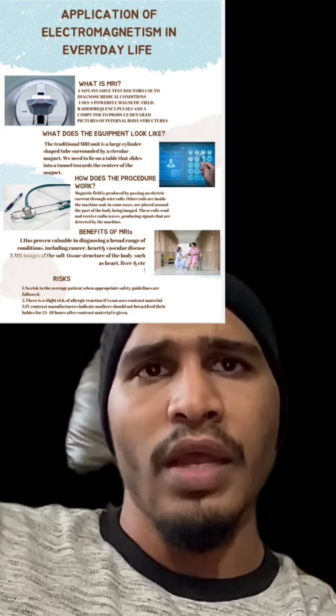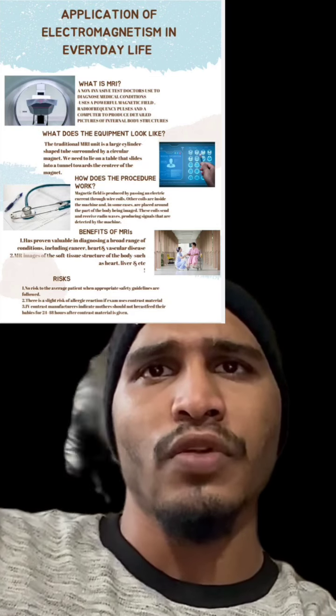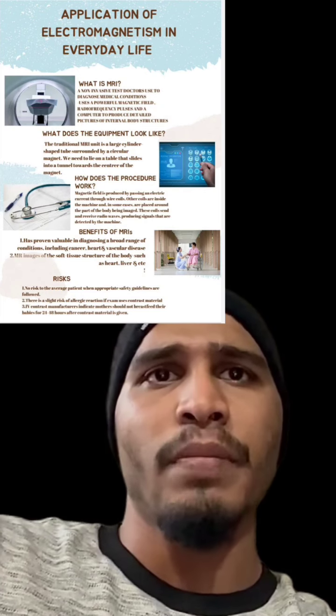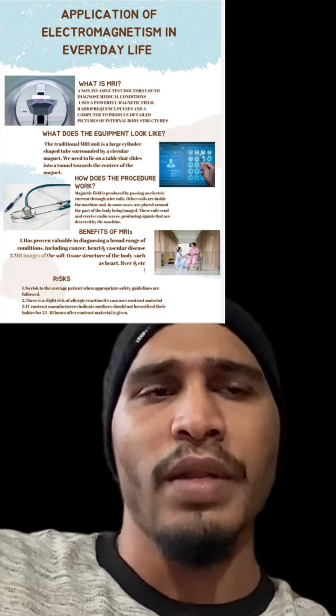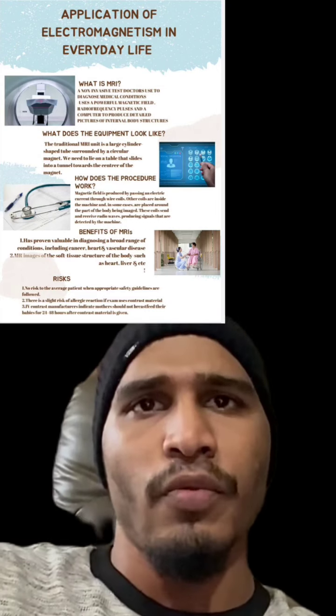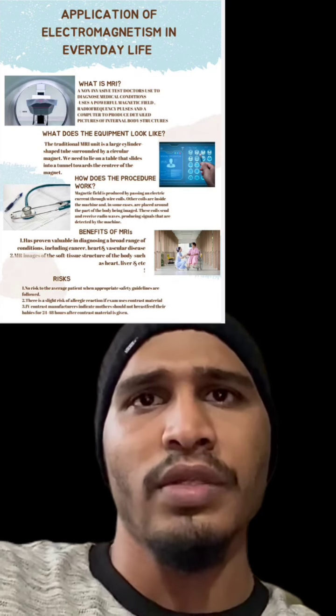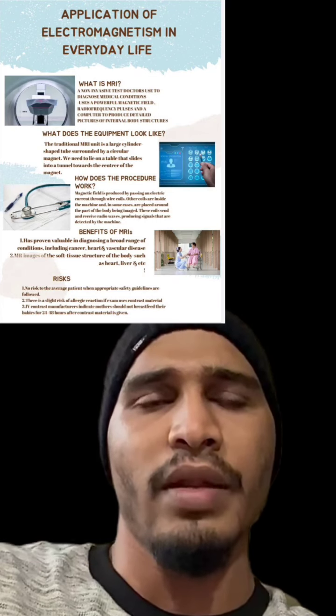How does MRI work? MRIs employ powerful magnets which produce a strong magnetic field that forces protons in the body to align with that field. When a radiofrequency current is then pulsed through the patient, the protons are stimulated and spin out of equilibrium, straining against the pulse of the magnetic field. When the radiofrequency field is turned off, the MRI sensors are able to detect the energy released as the protons realign with the magnetic field.